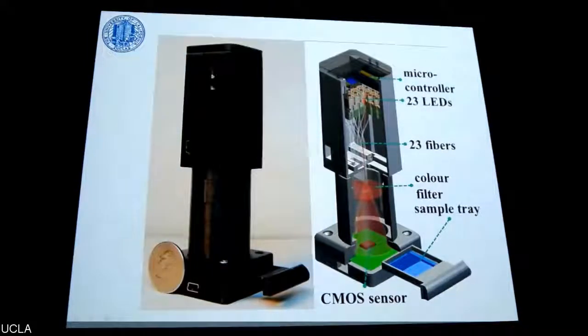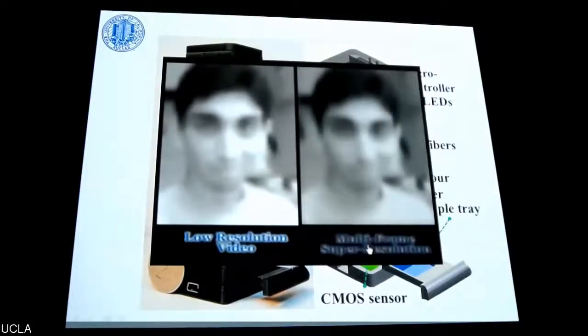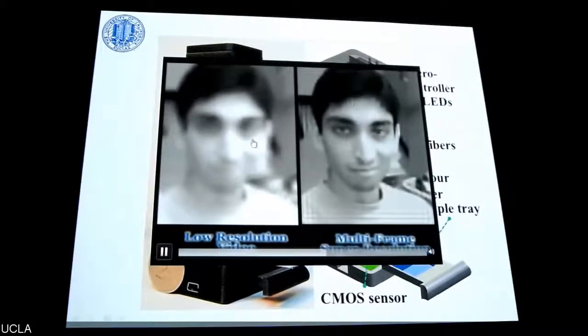If you look at one of these devices, it's still lens-free. The sample goes in from the side. It sits above the CMOS imager. Sometimes we call these types of microscopes on-chip microscopes, meaning that the sample sits on that silicon chip. Instead of a single LED, now we have some 20 LEDs. The main function here is to computationally divide the pixels of the CMOS imager so that we can achieve better resolution. This is the same mathematical framework that's used in security cameras. If you look at a security camera that's far away, your face is pixelated.